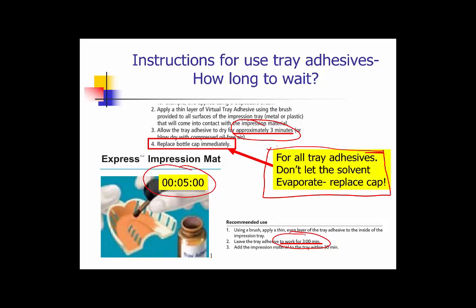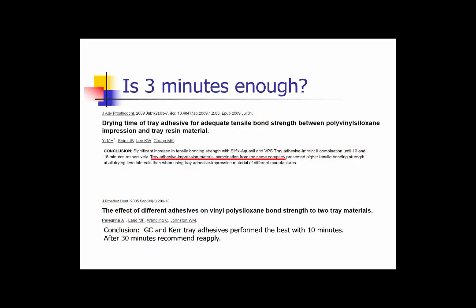And the same is true of your composite resin, your bonding adhesives. If you're using a bottle, make sure they're screwed shut. And then again, is 3 minutes enough? Did the manufacturers come up with a number that would be short enough that we would not be bothered by it? And keep in mind, for most of our trays, who's painting the trays? Our assistant is, our chairside assistant. In fact, we'll try the tray in, our assistant will place it and paint it, and then we'll get to it. And fortunately, in many cases, we're doing the tray try-in before we're doing our preparations and setting it aside.